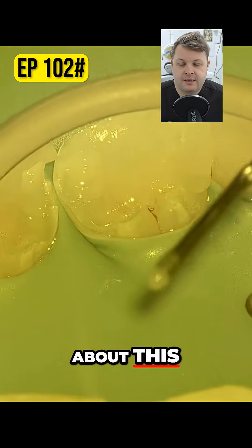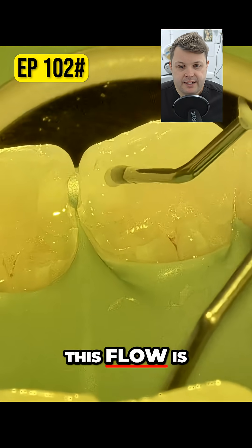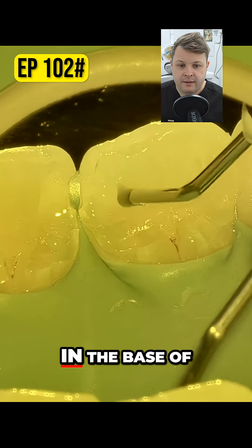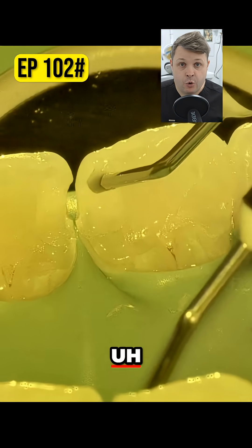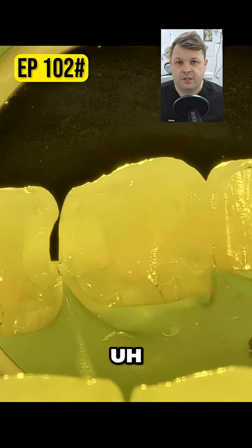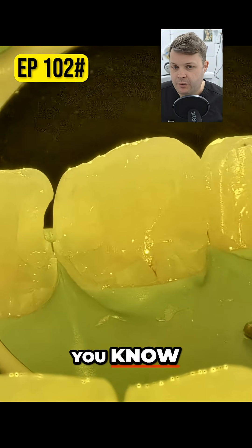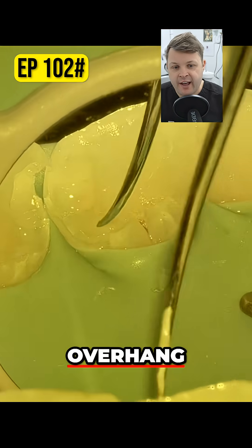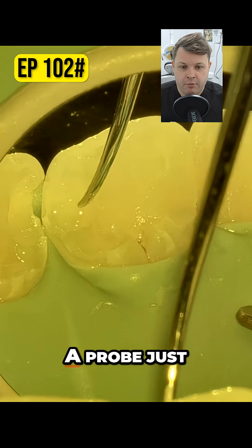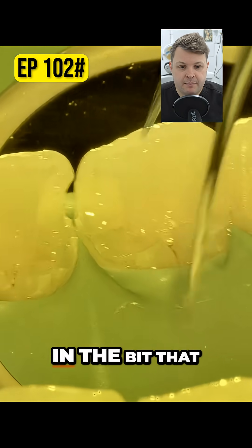The great thing about this flow is that once you've placed it in the base of the cavity, you can manipulate it quite easily to place it in areas which you need to flow it into. So maybe there's a very, very small overhang — you just use a little probe to place it exactly where you want it.